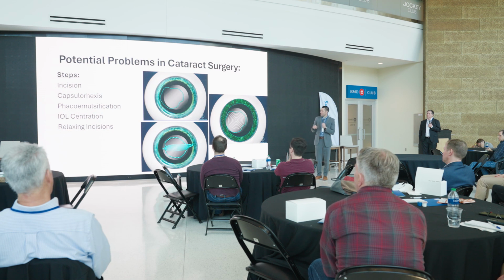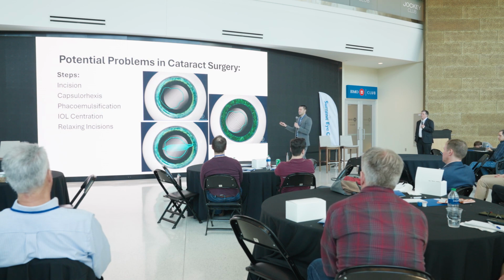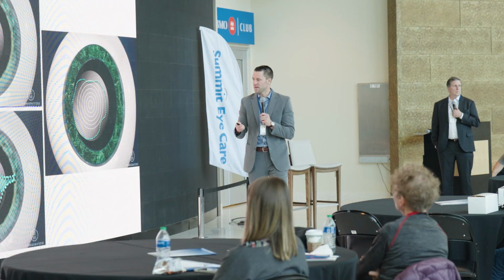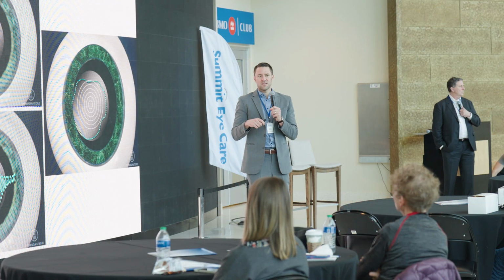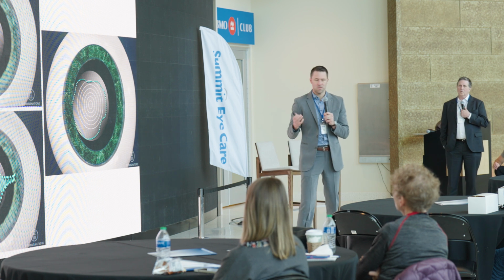And then number 5, a lot of what we do is relaxing incision. We're addressing astigmatism at the corneal plane. And so relaxing incisions or astigmatic keratotomies made with a laser, more accurate, more repeatable.